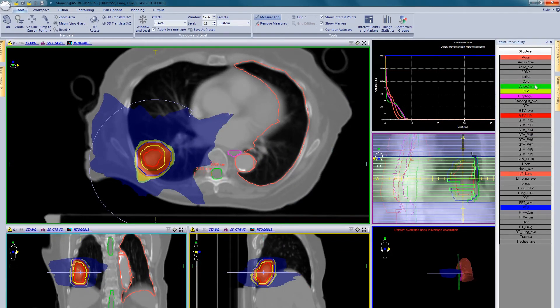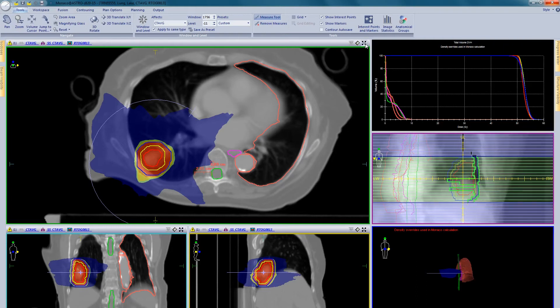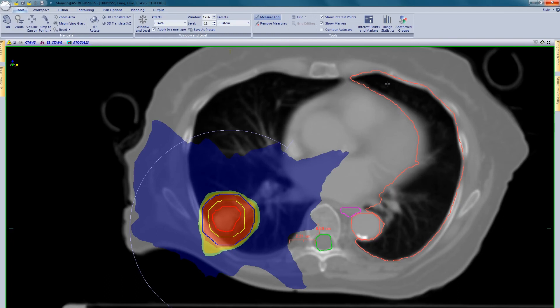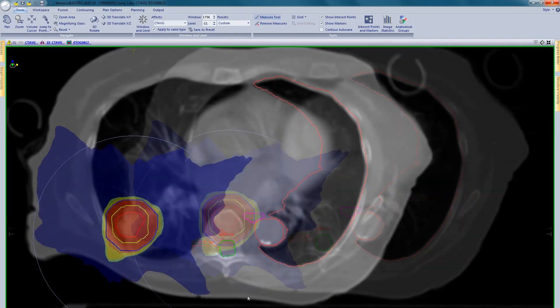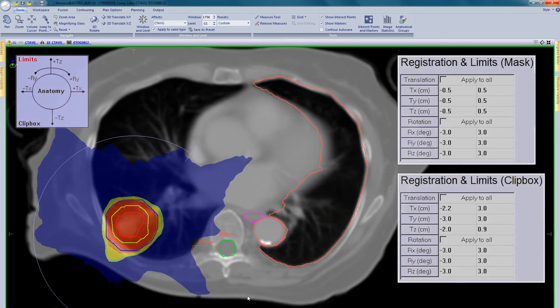Some customers may choose to define their limits by moving the ISO centre towards the critical structure and re-optimising the plan to see the effects on the DVH of this change. Here we have overlaid the relevant section of the XVI software so you can see the limits entered originate from the treatment plan.